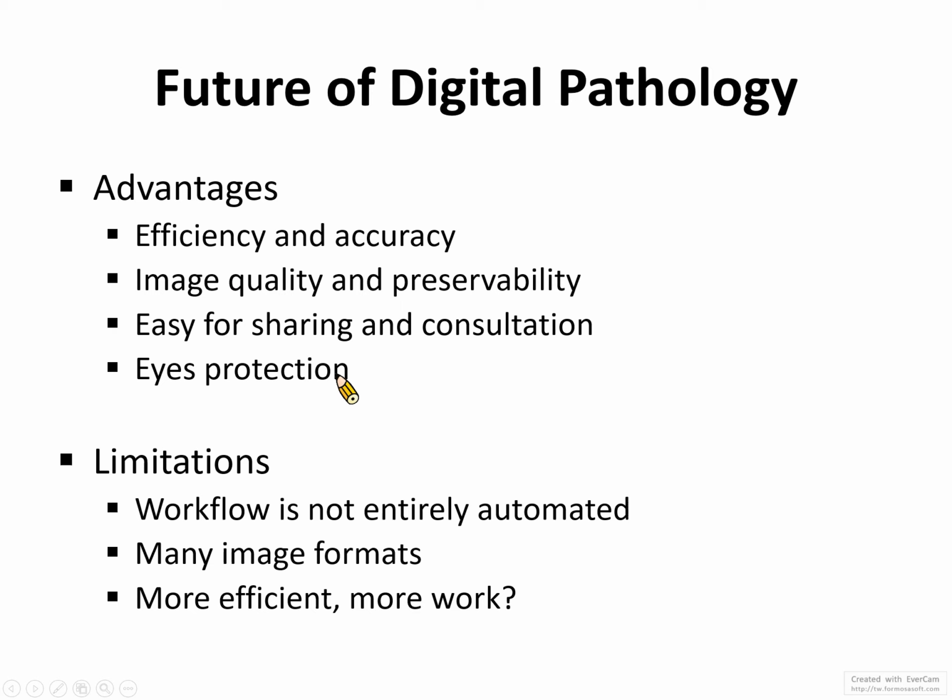But there are some limitations, because in the current digital pathology, the workflow is not entirely automated, and you can imagine that some steps are not easy to automate. So if you are interested, you can consult a pathologist, and he or she will tell you which parts of the workflow cannot be automated. That is a limitation you need to overcome. And in digital pathology, there is still no standard for the image formats. So this needs to be overcome. We need to unify the image formats.